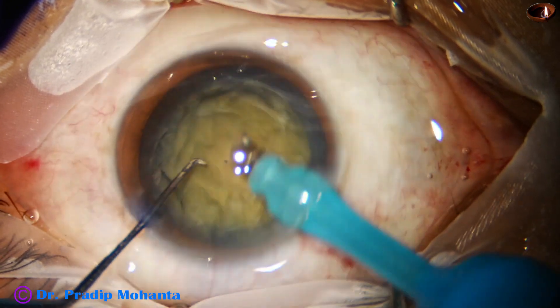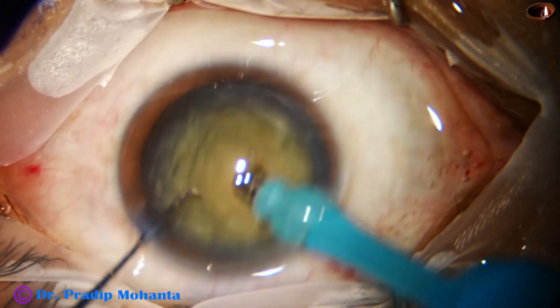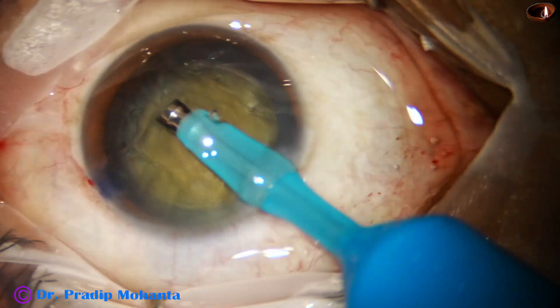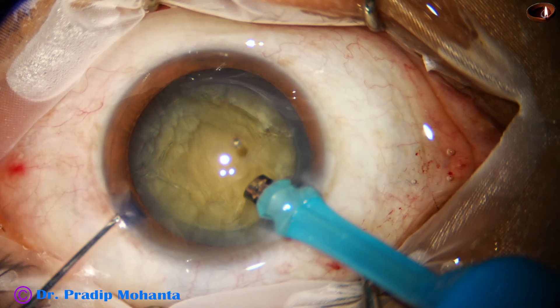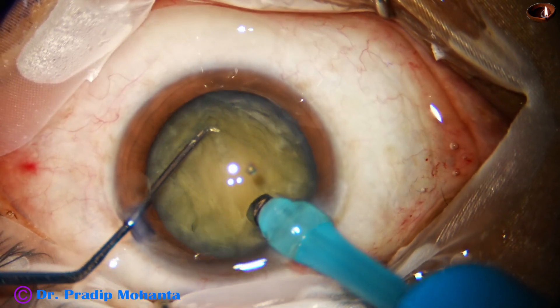Now the handpiece is turned to make the bevel up. This part of the video is in a bit of slow motion to show what I want to demonstrate — the use of the epinucleus as a contact lens.